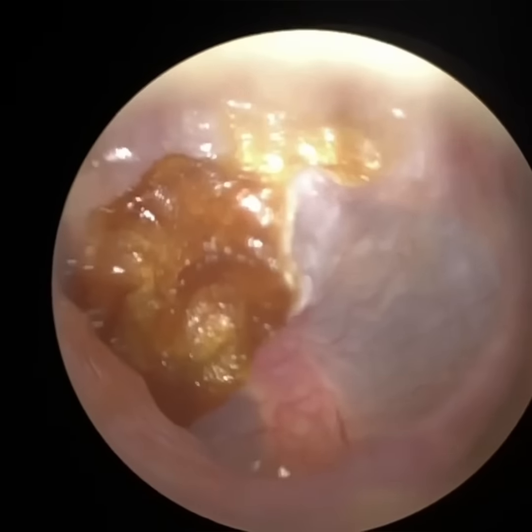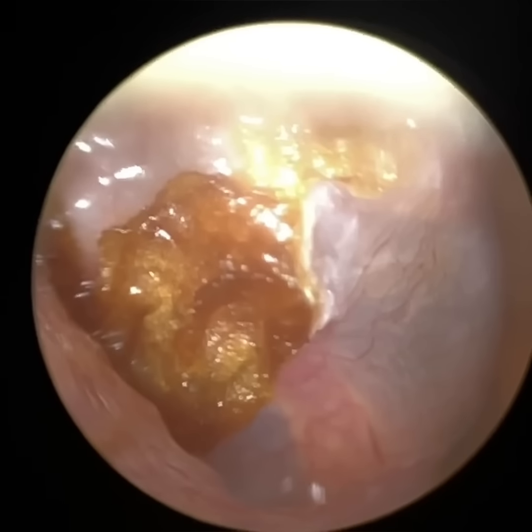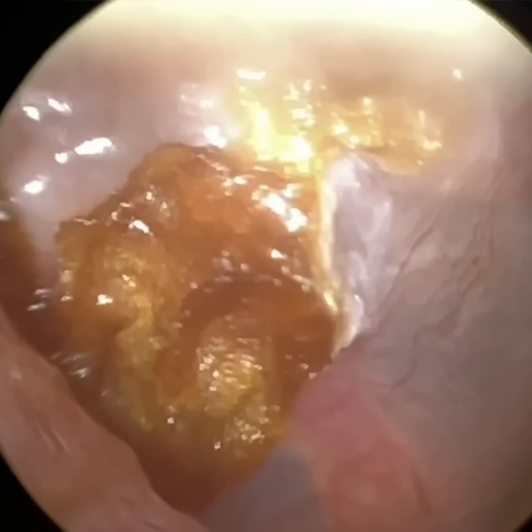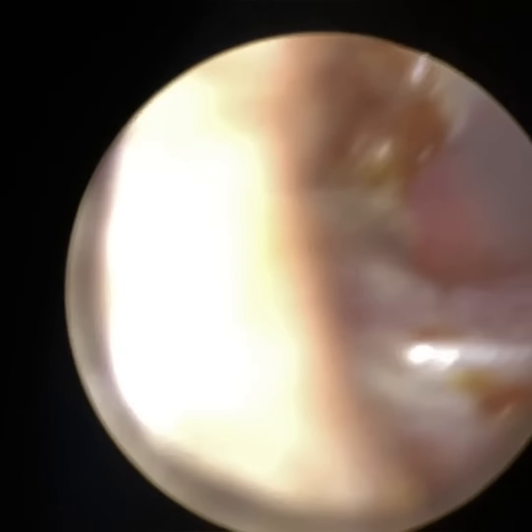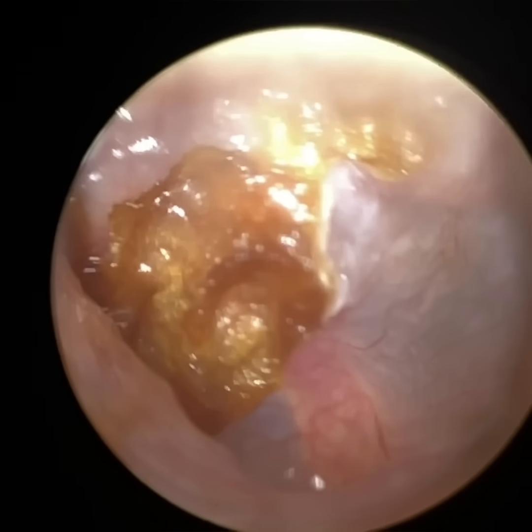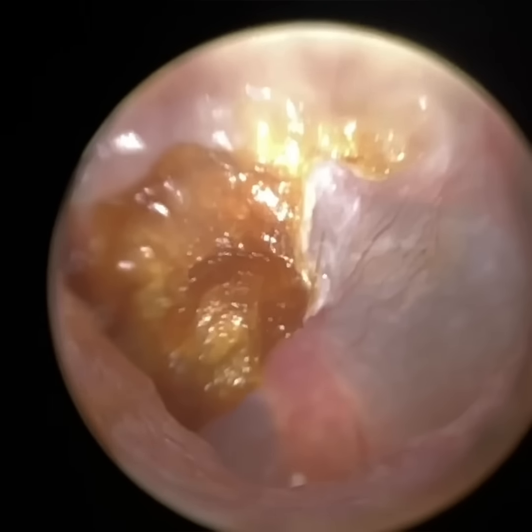When you're using the WAXscope or an endoscope, you're not utilizing that binocular vision. You're looking at a monitor. So it's a monocular view. Now, it doesn't mean you can't get depth perception using monocular cues. It's just a different mechanism. For example, here I'm using the focus. So when the object is in focus, I can judge the depth. So it's just the remaining skin.